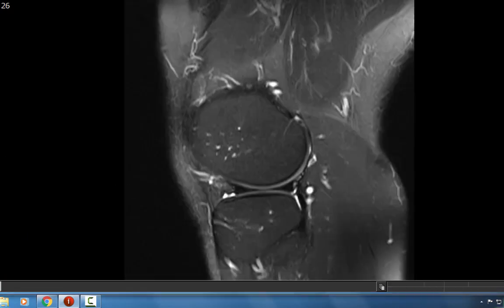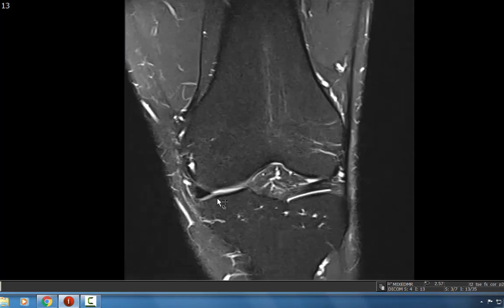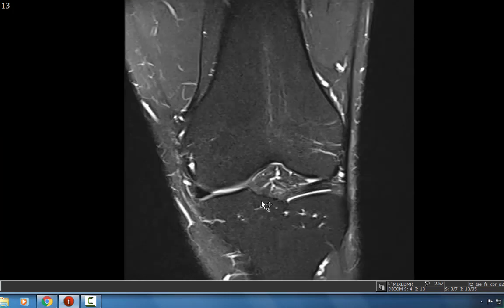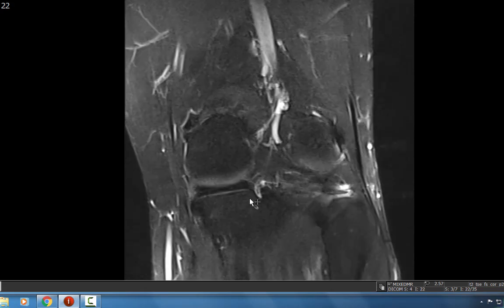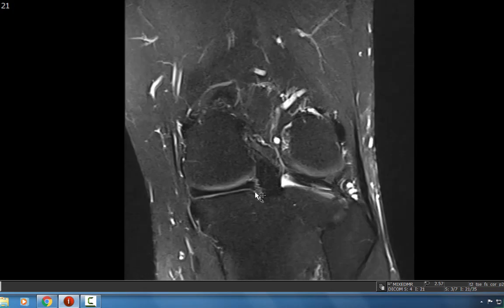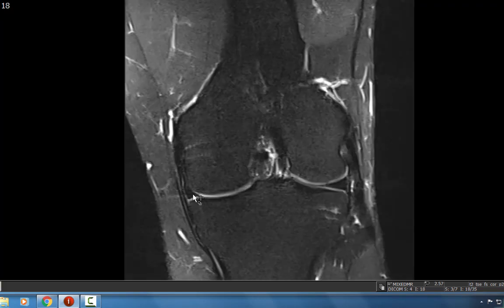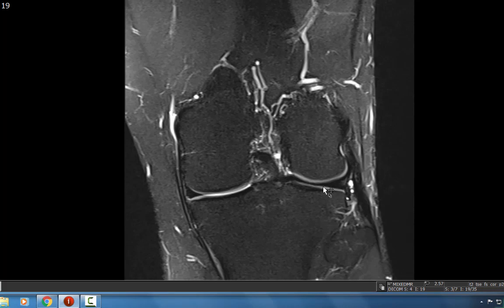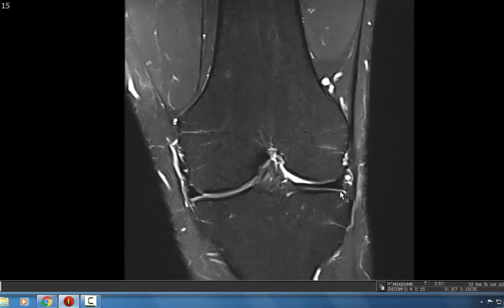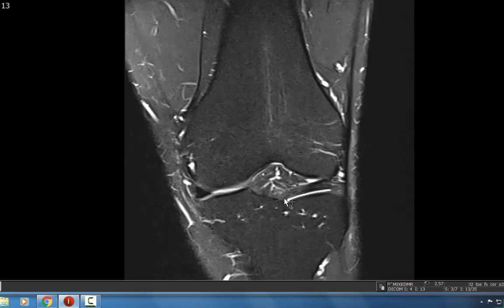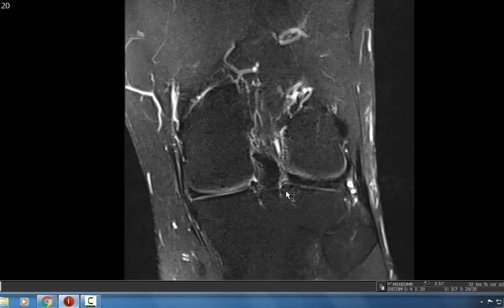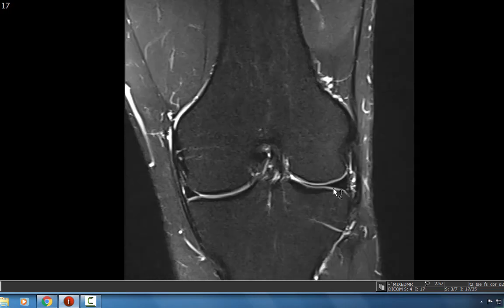You always want to evaluate the meniscus on the coronal slice as well. You want to make sure you can trace it to its anterior root and then trace it to its posterior root along the tibia. You want to make sure it's not displaced medially or laterally more than three millimeters, because that could indicate a displaced meniscal tear. For the lateral meniscus, you trace it from its anterior root all the way to its posterior root, making sure it's intact.